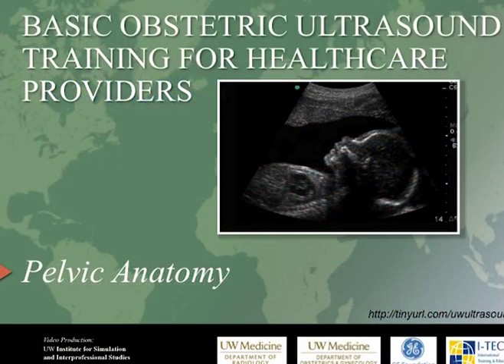My name is Dr. Christina Adams Waldorf, and I will be narrating the 7th video in our Pregnancy Ultrasound series. This video will teach the basic anatomy of the female pelvis as seen with ultrasound. Please visit our website for access to all of our videos and training materials.